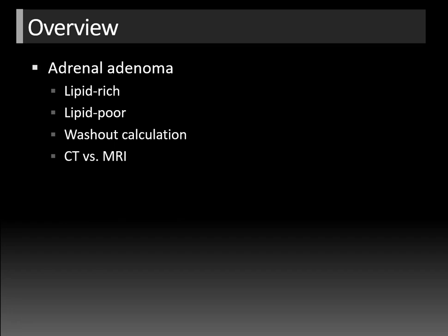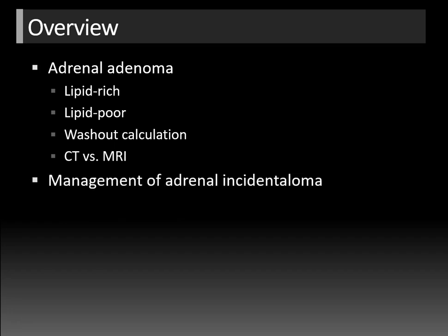is the best modality for a particular nodule. We'll finish with management of adrenal incidentaloma discussion, comparing the endocrinology guidelines versus the radiology recommendations, which is a bit of a controversial topic.